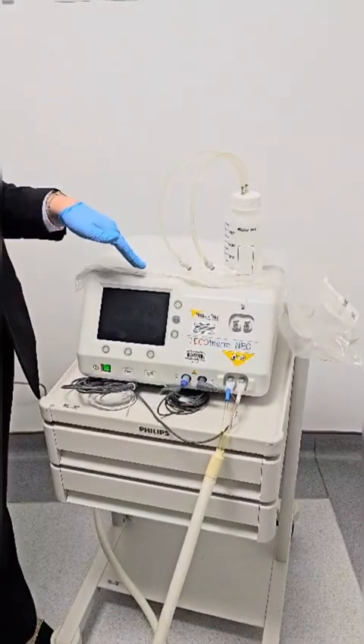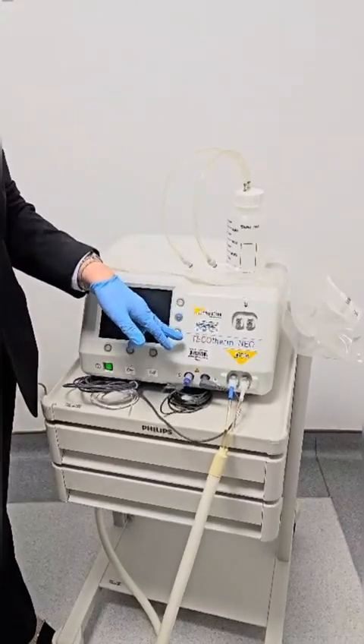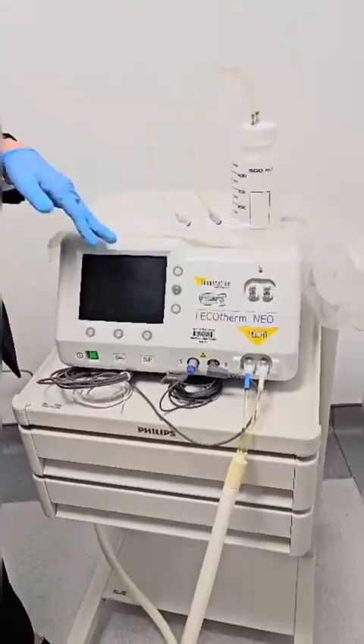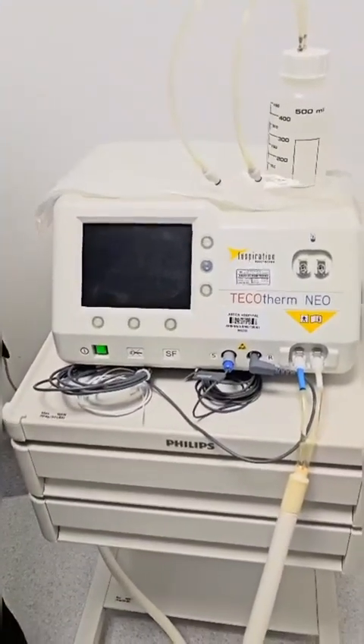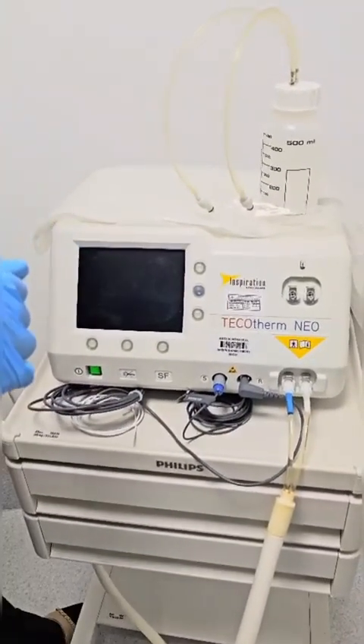Good afternoon. We are having here from Inspiration Health Care, TECOtherm NEO, which is a device used to cool the baby when he is having hypoxia.